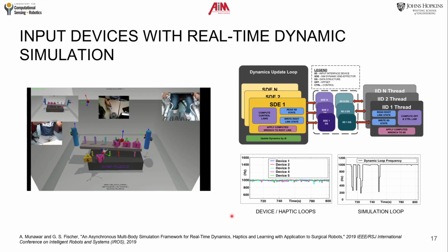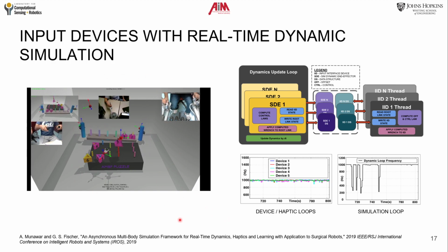Shown in this slide is an example of 5 input devices interacting with the real-time dynamic simulation. Due to the asynchronous design of AMBF, the haptic devices can update at the desired frequency, thereby taking the load off of the generally expensive simulation loop.